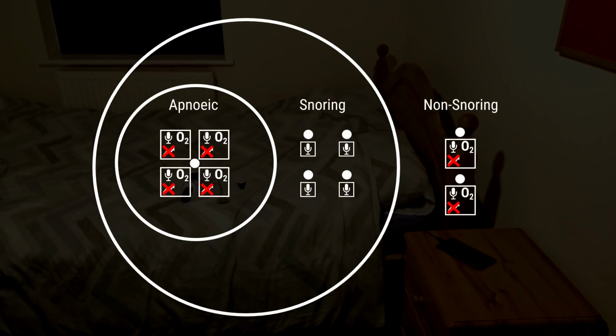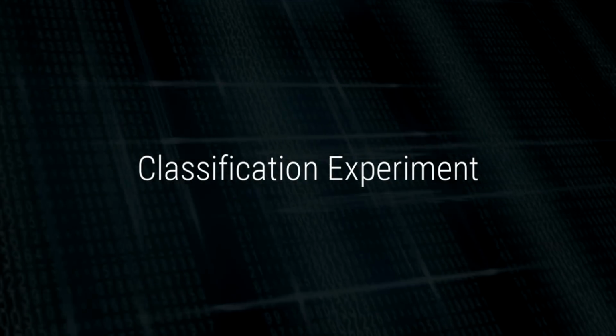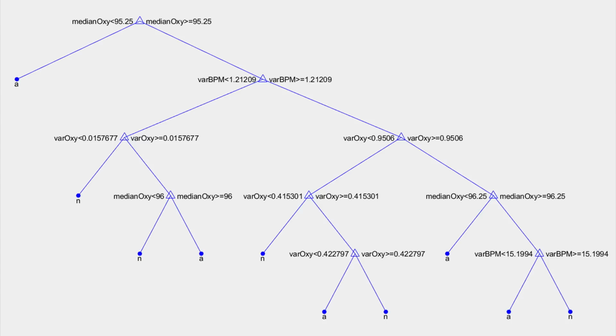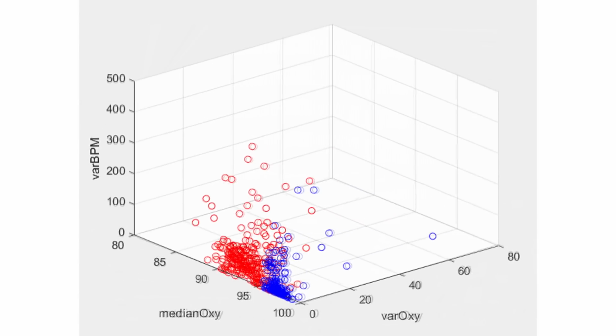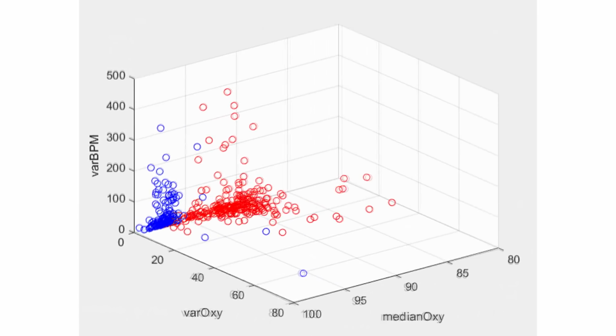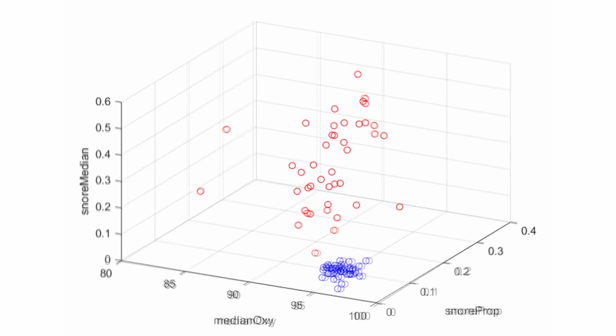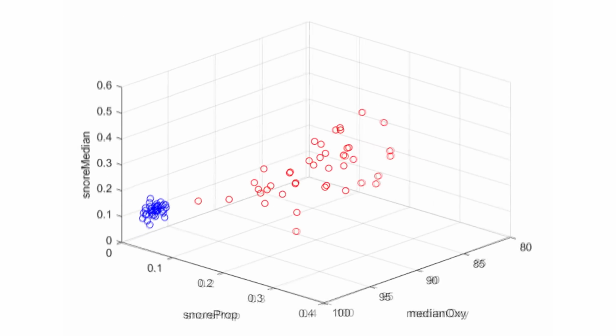There are various types of classifiers that one can use when attempting to separate data into different groups, but we chose to train binary decision trees in order to visualize the choices made. I trained decision trees on different combinations of the data in order to evaluate the sensor's effectiveness both individually and when used together. So how much potential is there for diagnosing OSA just using these methods?